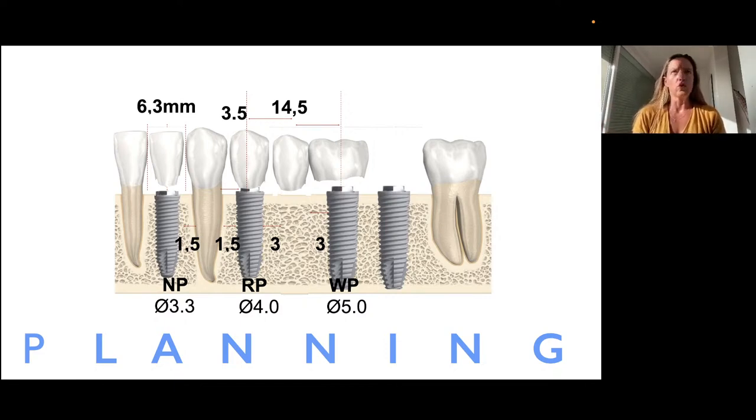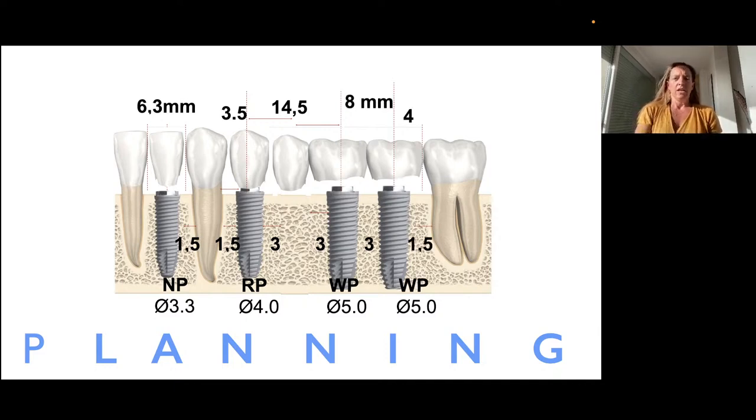You can also do a wax up in a model and do a guide, just a transparent guide where you know exactly where the crowns of your teeth are going to be to guide you with the drillings. But if you go freehand, this is always the basics that you have to know. Okay?